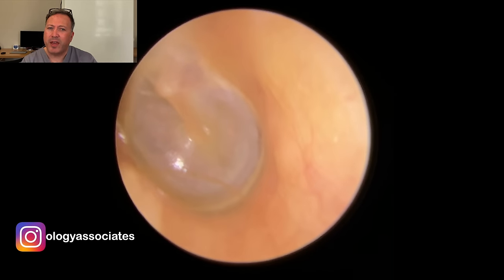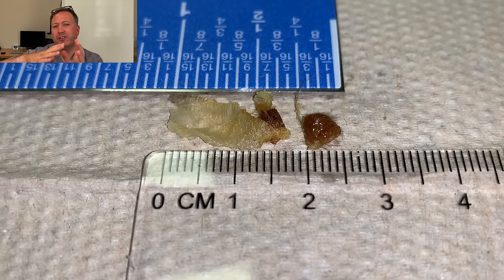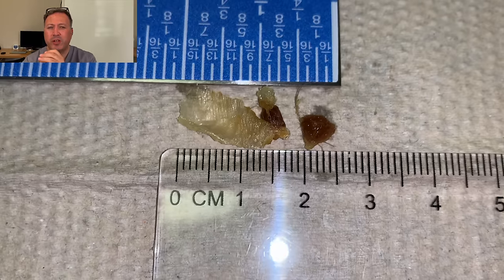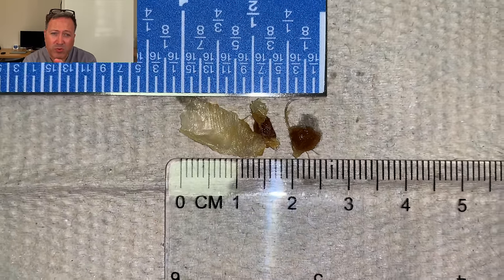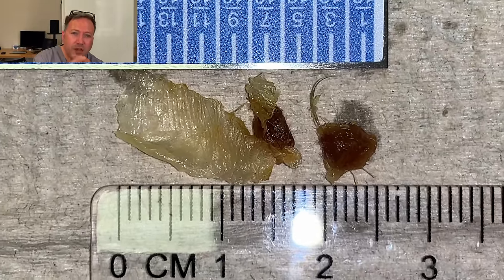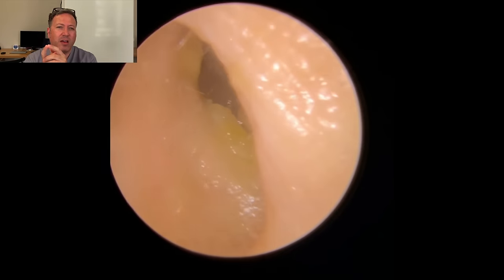And there's the eardrum there. Not such a good light reflex on that one. You can see it was just slightly diffused because the eardrum probably isn't sitting in its normal position. Look at that skin ribbon there. So we're up to just over a centimetre and a half. I've zoomed in too quick. Can't do the inches at half. And just about an inch and a quarter altogether.